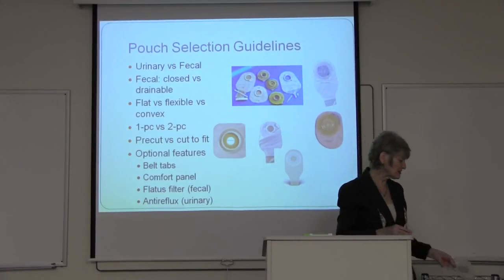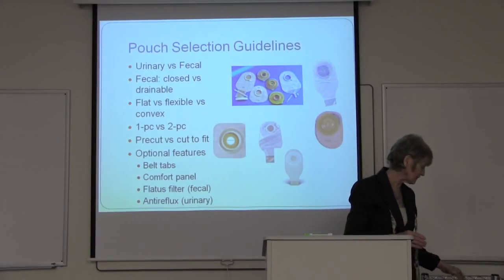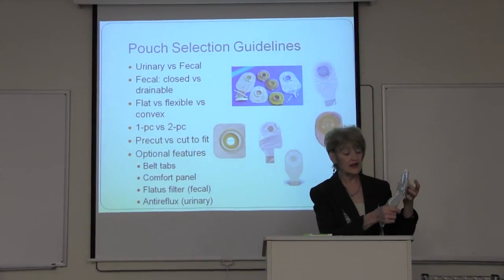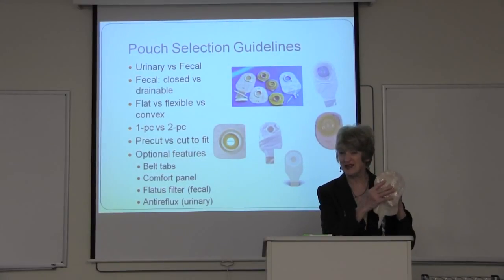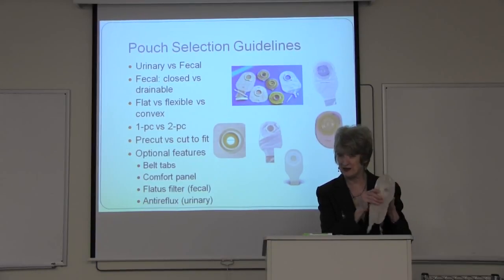And then when you come on site, we'll explain that urinary pouches have something called an anti-reflux valve. The anti-reflux valve just helps keep the skin dry, and I can show you that much better when you're on site. It's not going to show up on the video.